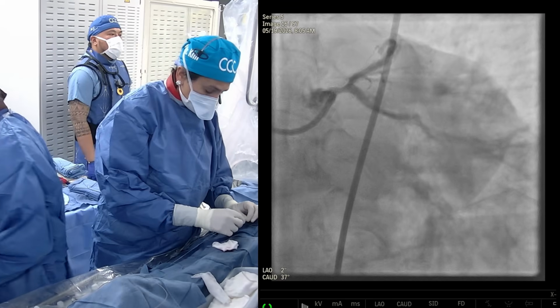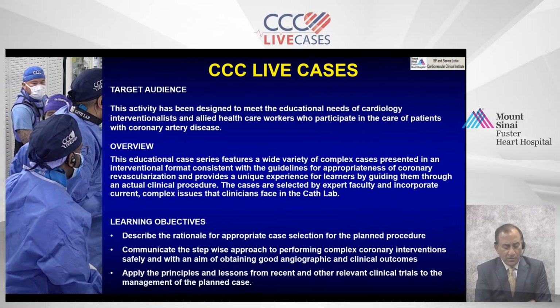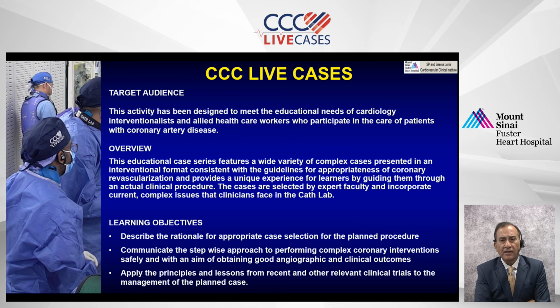So with that note, let's go to our presentation, please. So, let's start. Samir, quickly, Anu, educate us once. With a somewhat short left main, what was your approach towards selecting the guide?